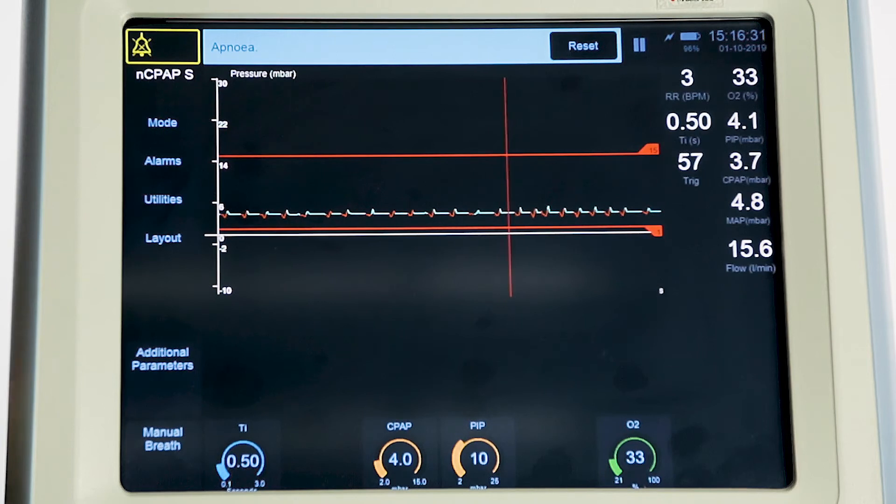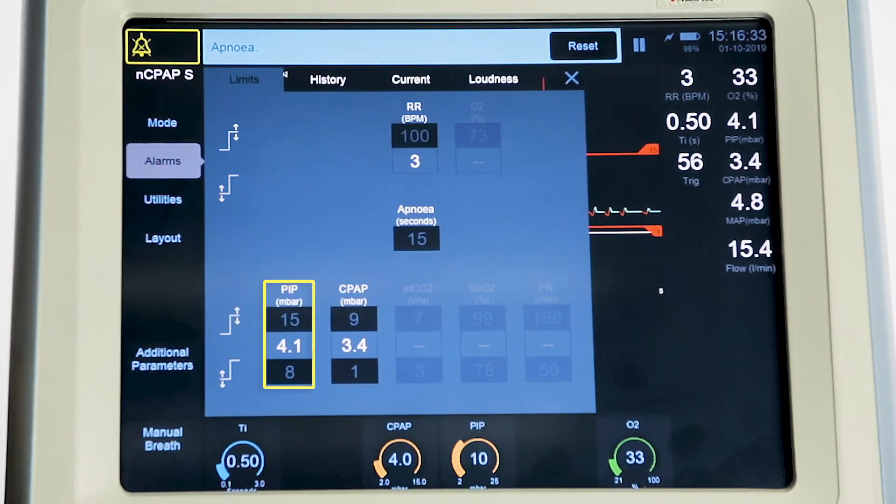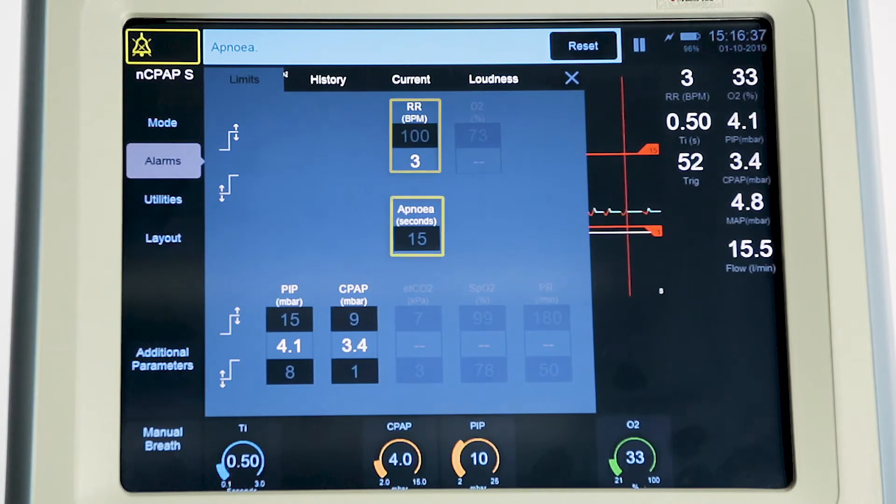Alarms include high and low PIP, high and low CPAP, high RR and apnea time. Apnea alarm can be turned off. CPAP alarms are auto-set and can be user-adjusted.